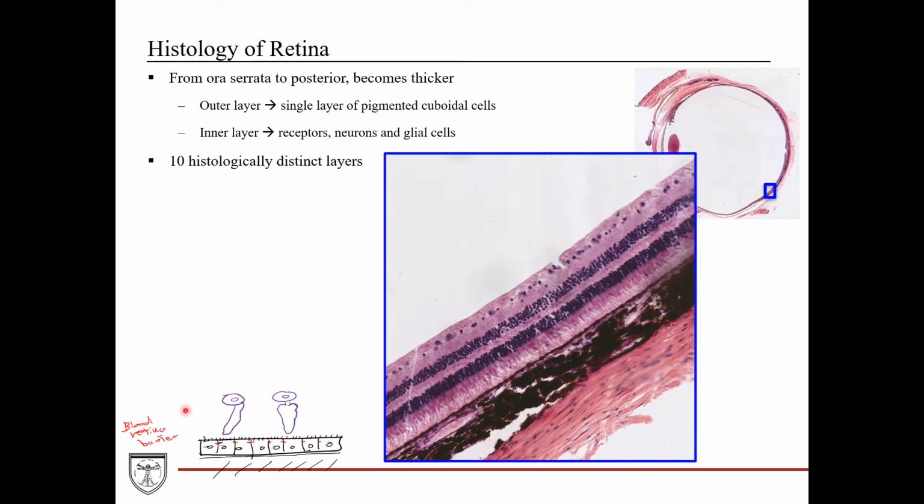These are specialized neurons with the receptor portions that look like either rods or cones like these. The receptors of the rods and cones are embedded within these microvilli of the outer pigmented epithelium, but there are no cell-cell junctions occurring between the receptors and the outer pigmented epithelial cells, which means this is the intraretinal space that used to be during the developmental process.